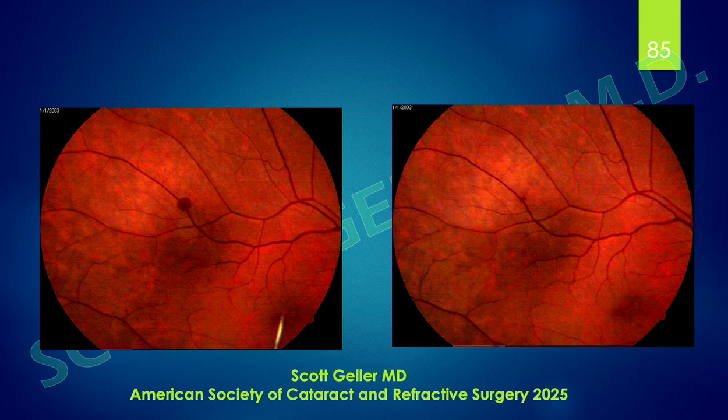I've had a case where we did a fluorescein angiogram, showed virtually nothing. The patient stated he never saw anything, did visual fields, et cetera, which is good. These things occur usually when you're off axis. When I say off axis, I mean in the periphery of what you can see with the contact glass on the eye.